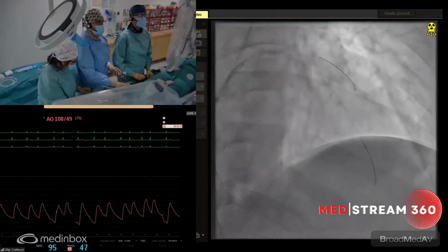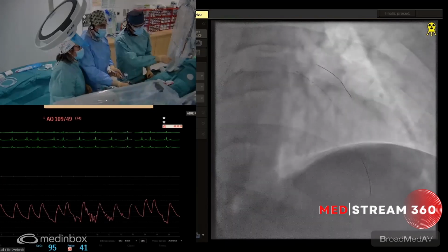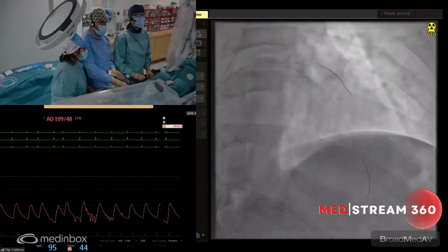But I'm crossing, you can see. ¿Le das la terapia, Patri? Sí, el amarillo, por favor. The yellow signal. Test, please, Pilar.